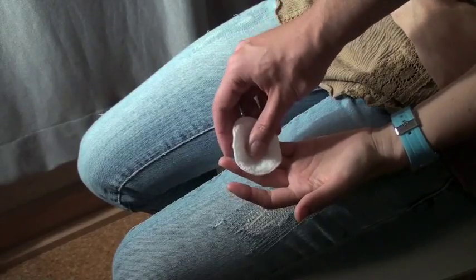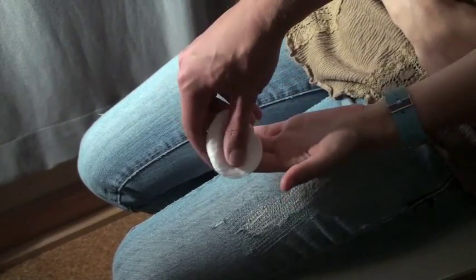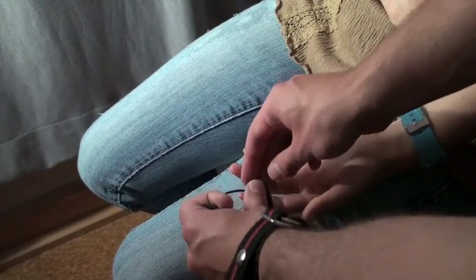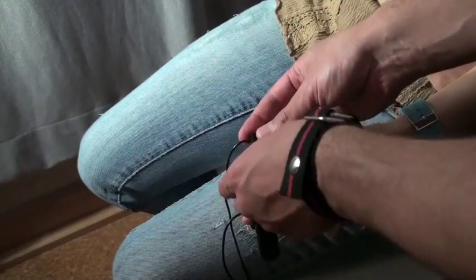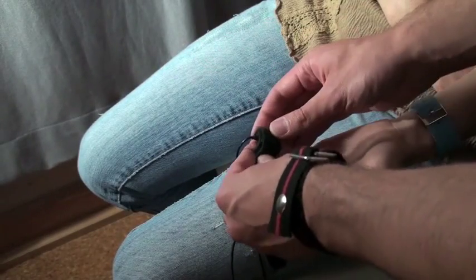After cleaning the participant's fingers with alcohol and letting them dry, wrap the electrodes around the participant's index and ring finger. The electrodes should be snug, but not too tight, and be sure to ask the participant if they're uncomfortable. To check that the GSR electrodes are receiving a signal, ask the participant to take a deep breath. The SCL response should rise a couple seconds after the breath is taken.